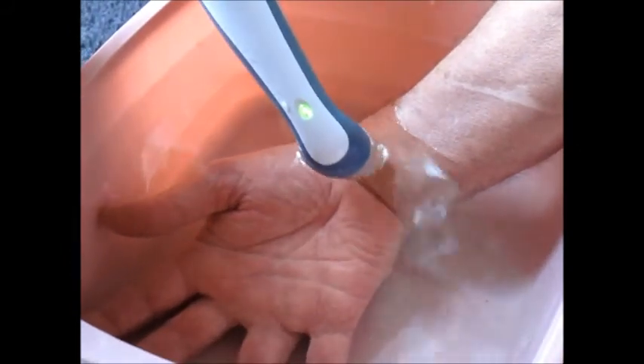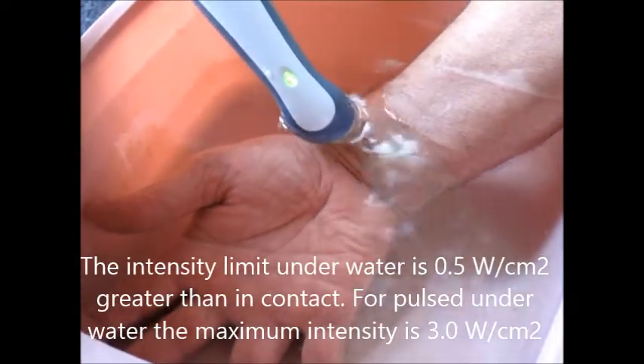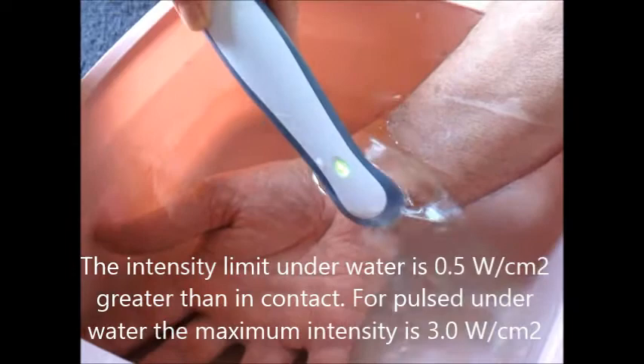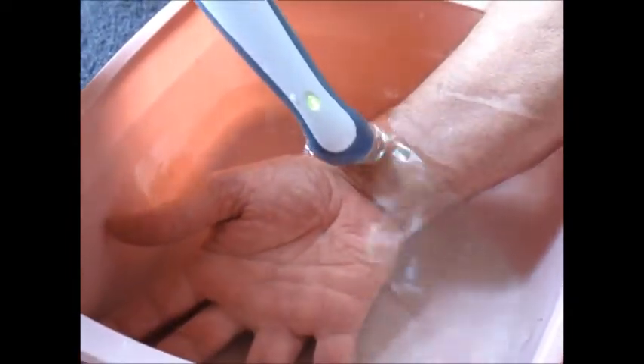There is a limit with ultrasound under the water — you should not go above 3, but this Chattanooga actually maxes out at 3. If I was in contact with pulsed ultrasound, the maximum would be 2.5 watts per centimeter squared.